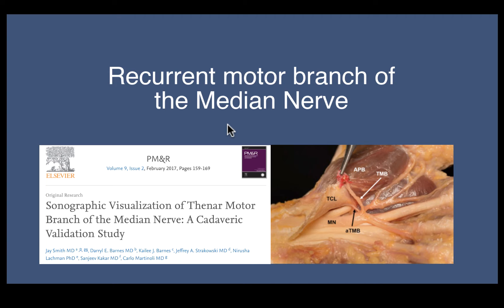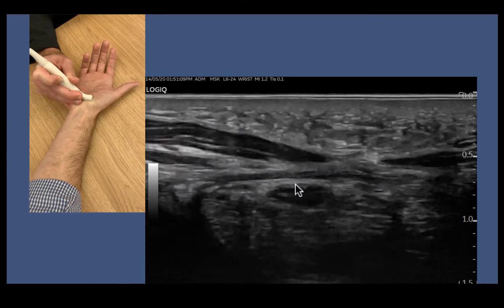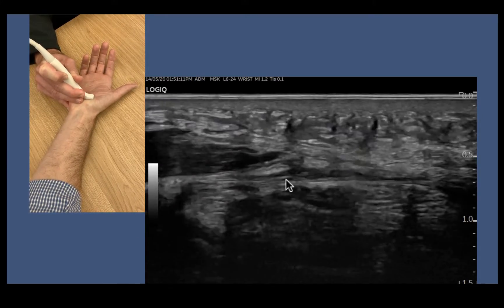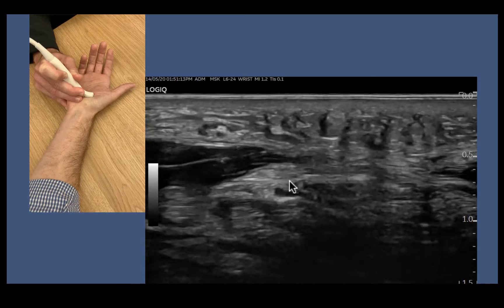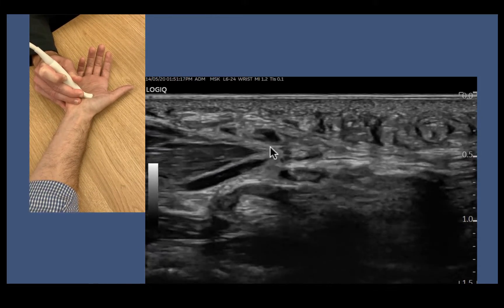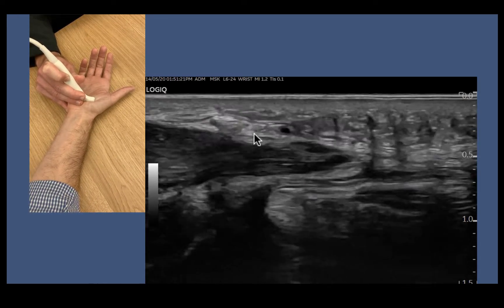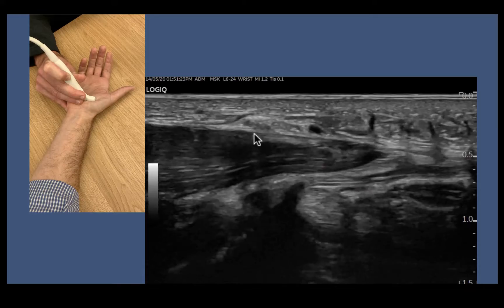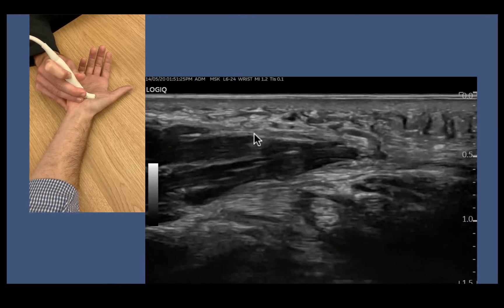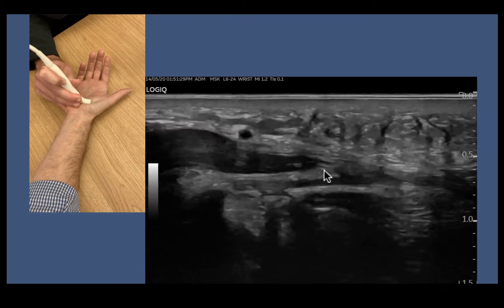Then we have the recurrent motor branch of the median nerve, and this is a real true test of what a probe can do. As we follow our median nerve down out of the carpal tunnel to the distal end of the carpal tunnel, we watch and see a little branch run out, run up, and run over the thenar eminence. This is the recurrent motor branch and we see it really nicely as it runs superficial to the thenar musculature, piercing out through that fascia.